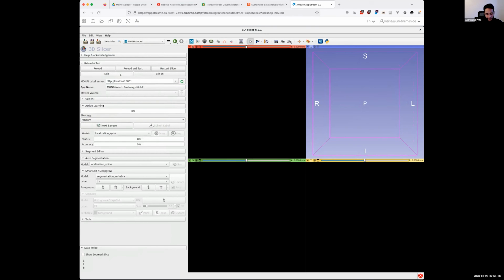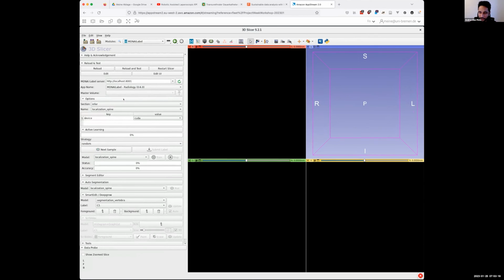We open an issue. I mean, Sachi opened an issue at the other MONAI Label developer to also reduce the installation process of MONAI Label, or the start server of MONAI Label, on Windows and Linux. So the idea is to facilitate that as well.